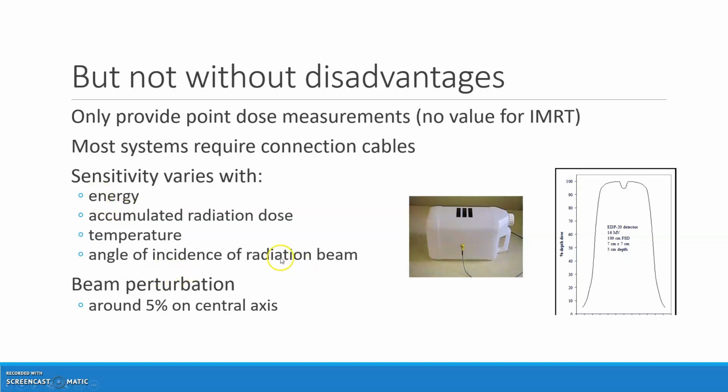So that's important. Now what we can do, as we can see here, is we can calibrate them at skin temperature, average skin temperature, or we can just use a bigger tolerance. So this was filled with hot water, wait for it to get the temperature gauge on the top, little thermometers, and then when it's at the correct skin temperature, calibrate them, measure the dose that's being delivered.